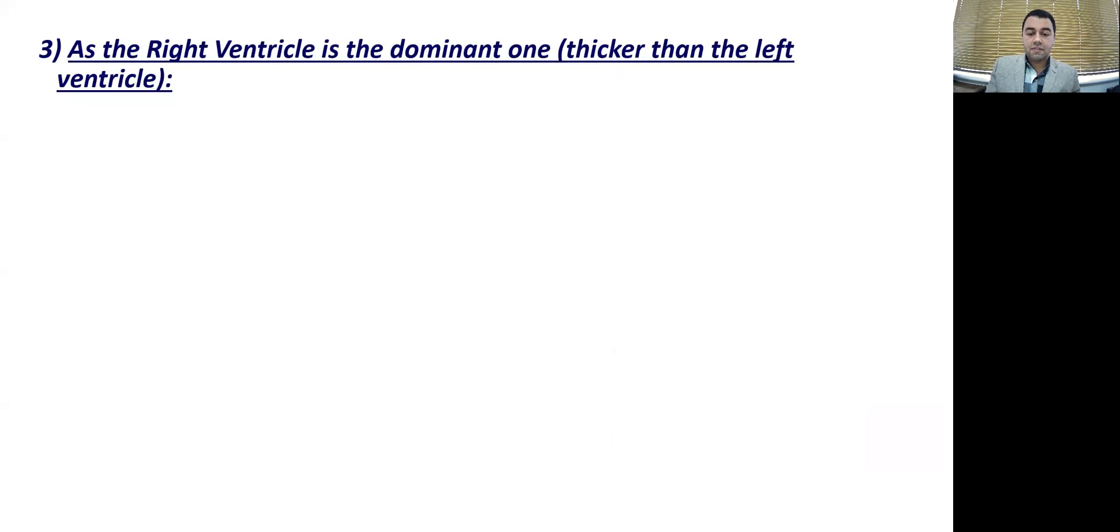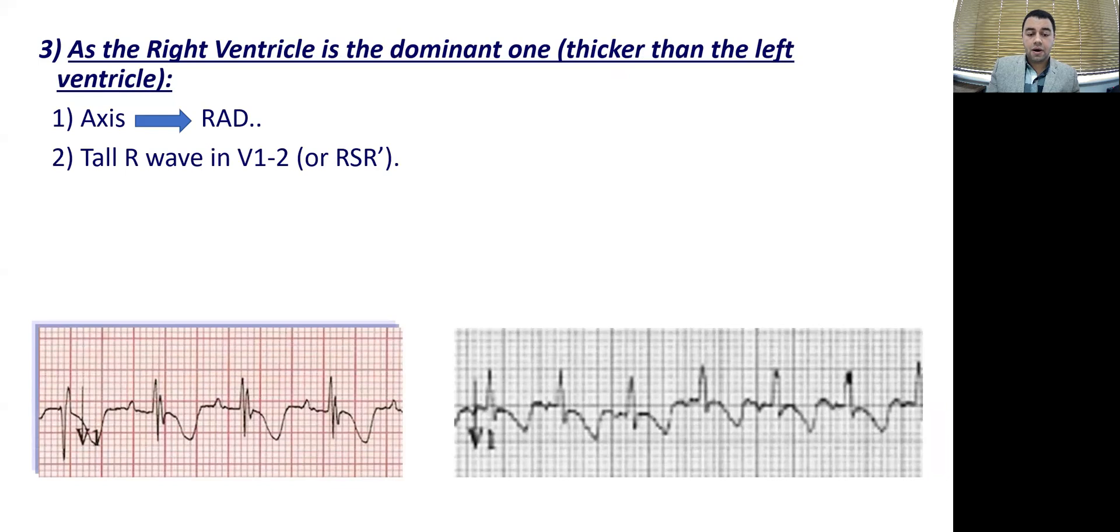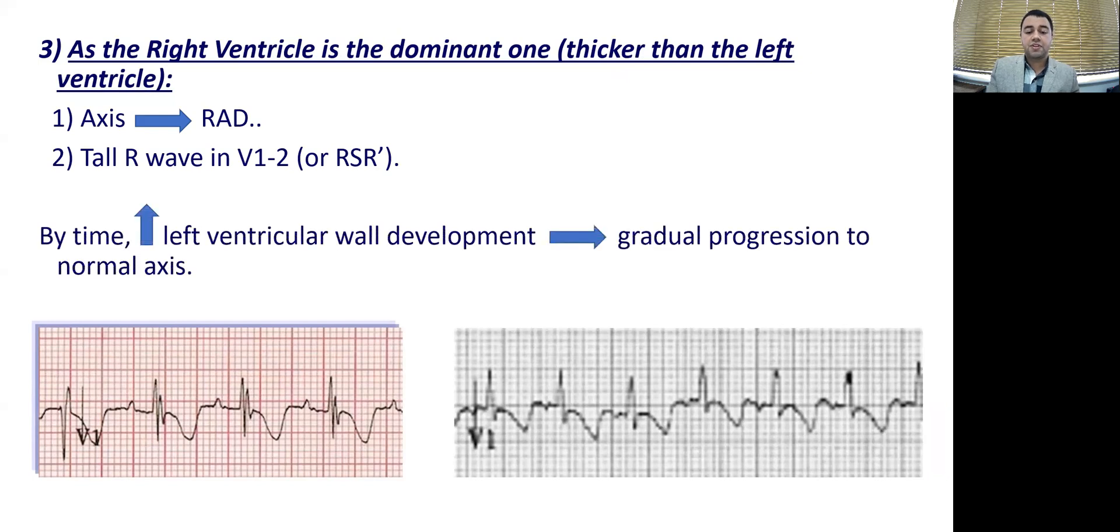Let's move on. We know that the right ventricle is the dominant one. And we know now why it's thicker than the left. Based upon this, that will affect the ECG dramatically. You will get a right axis deviation based upon that. And you will get a tall R or RSR dash in V1 and V2. You will get a right bundle branch block picture in the ECG. And that is because of the difference in thickness between right and left compared to adults. And by time, the left ventricle will start getting more developed. And gradually, the axis will gradually progress to be a normal axis. And the right bundle will gradually disappear. That is the third difference between adult ECGs and pediatric ECGs.